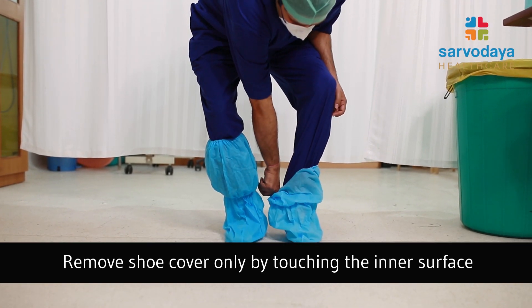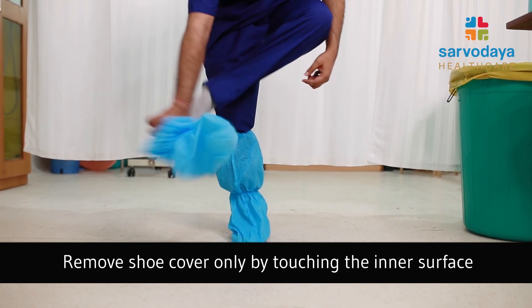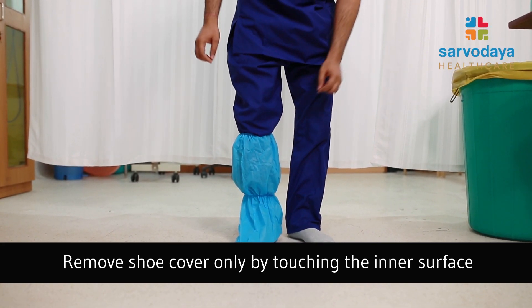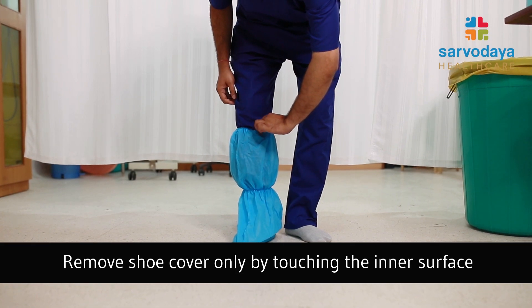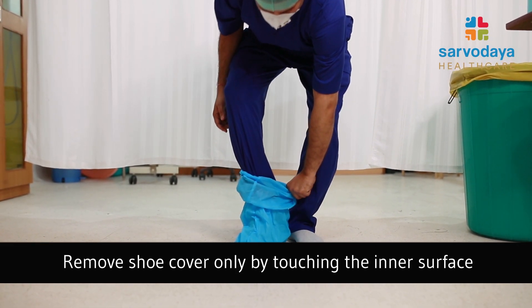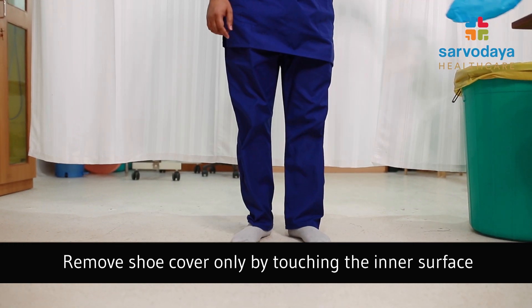Once the hand hygiene is done, we would like to remove the shoe sleeves. Again, put a finger inside the under surface and gently peel it off. We should always ensure that the contaminated surfaces should not be touched.